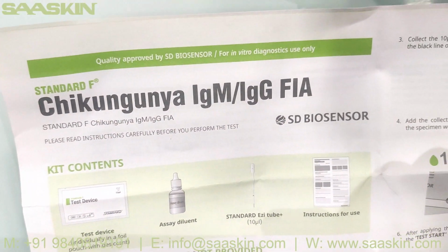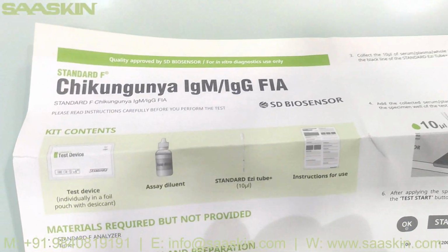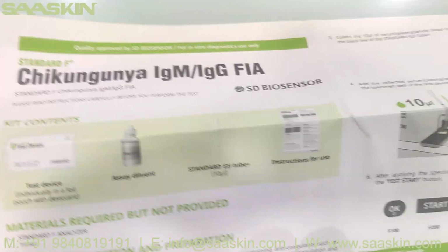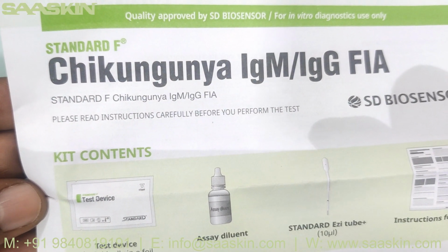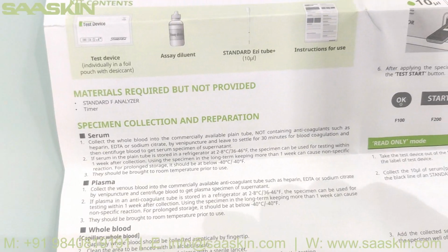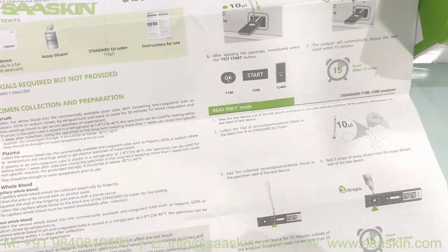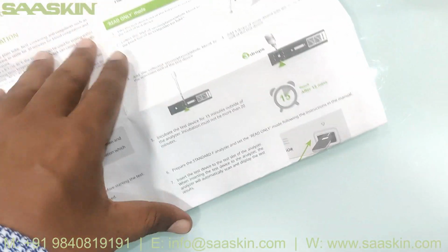You can see it's Standard F Chikungunya IgM IgG FIA. You can see the kit contents mentioned here, and the materials required, specimen collection, test procedure, test mode, the interpretation of test results, and the explanation summary. So you have the complete details to conduct the test. I'm just keeping it here.